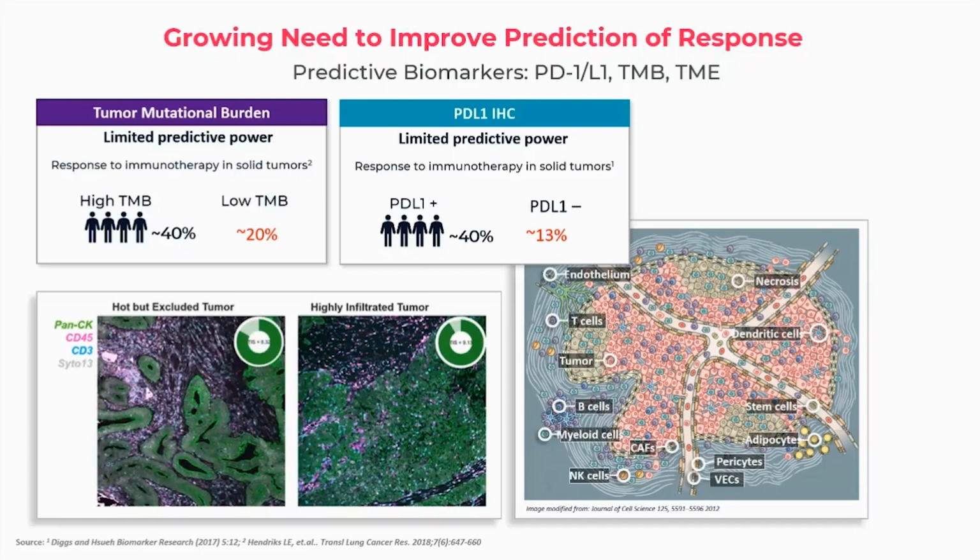What my lab does is try to understand how these cells communicate with each other, and with their immune cell subtypes and neighbors in the tumor microenvironment. We try to profile these cells almost cell by cell in the whole tissue. A typical slide will contain 2, 3, 4 million cells. What we try to do is annotate these and then look at the associations with clinical endpoints.